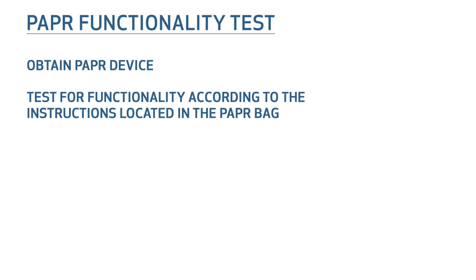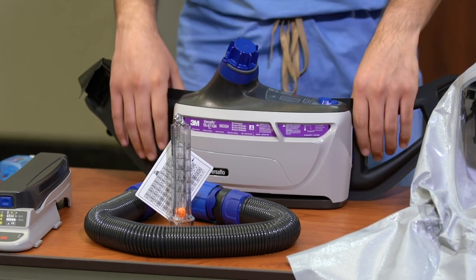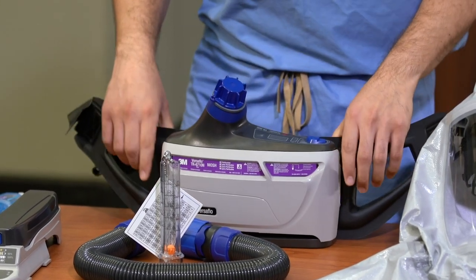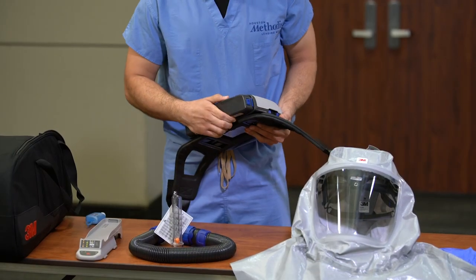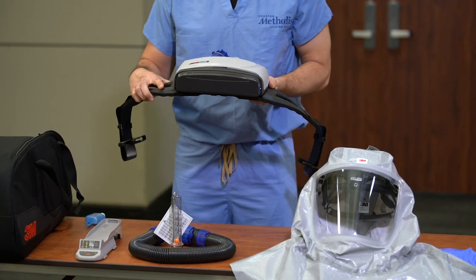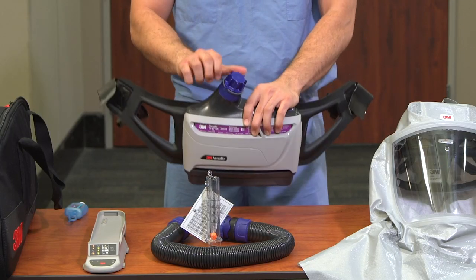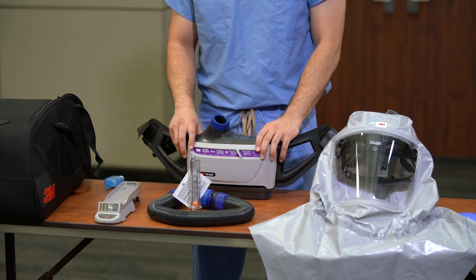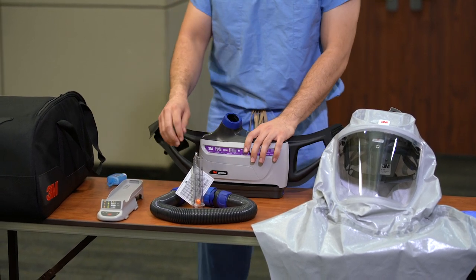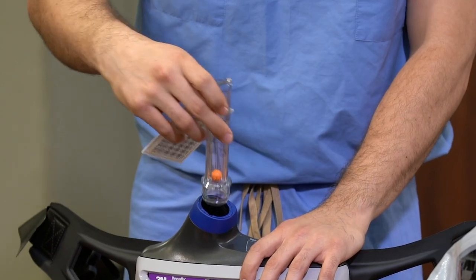Obtain the PAPR device and test for functionality. Remove the fan assembly from the PAPR bag and insert the battery at the bottom of the device. Remove the protective covering from the airflow port located at the top of the device and place the cover back in the bag. Remove the accessory Ziploc bag from the storage pouch and retrieve the airflow meter, then attach the meter to the airflow port.